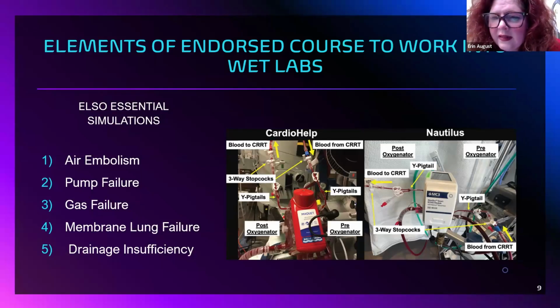If I do that and the patient stabilizes, then it could be that the first step I take is switching out the blender. If I go back to that and I'm still having issue, then the next thing I would suspect is that my gas at the wall is not good. So I'd have to go back to my tank and then work on either switching and maybe using a splitter, because we know we also have the ventilator, or do I need to talk to my charge nurse and move my patient to another room? These are things that we don't encounter often, but should be practiced more often so that we are ready for everything.